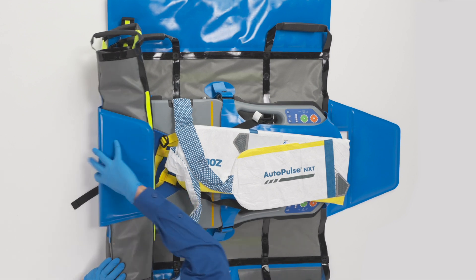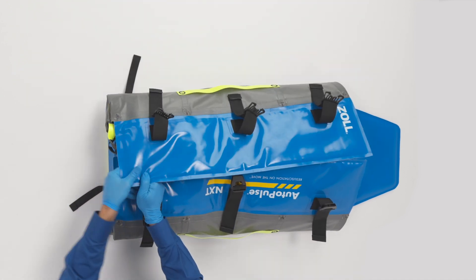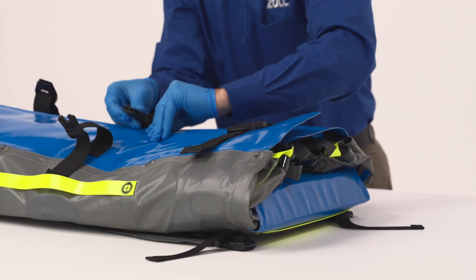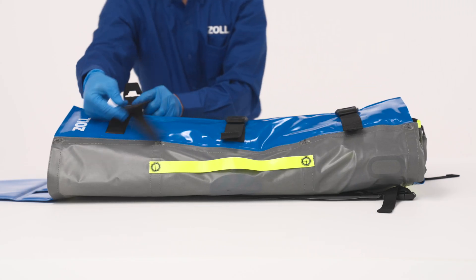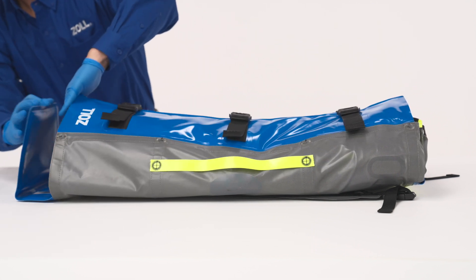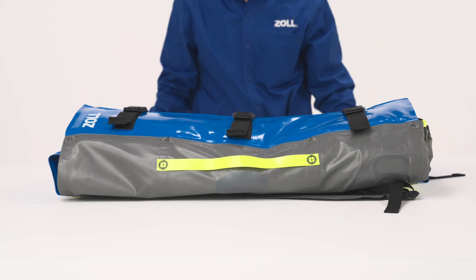Fold one side of the QuickCase Carry Sheet inward, then repeat with the other side. Secure the three black straps by connecting the buckles and tightening the straps. Once buckled and packaged with the AutoPulse NXT Resuscitation System, the QuickCase Carry Sheet becomes a backpack for providers to easily carry the device to the scene of a sudden cardiac arrest.